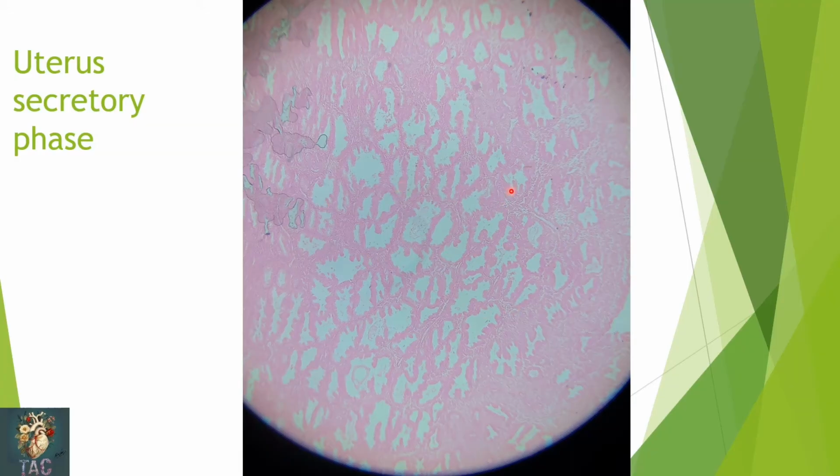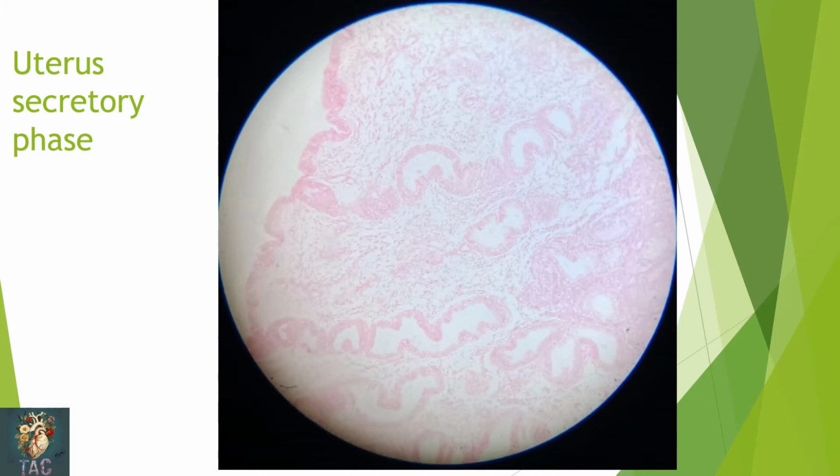So this is the uterus at the secretory phase, and for your identification you can see the corkscrew shaped glands with the sacculated lumina over here. Again a beautiful diagram through the secretory phase. Here you can see intact epithelium and the corkscrew shaped glands. You can see also the edematous stroma over here, and because the edema fluid is washed out during slide preparation, the empty appearance of the slide shows you that these decidual cells are edematous.